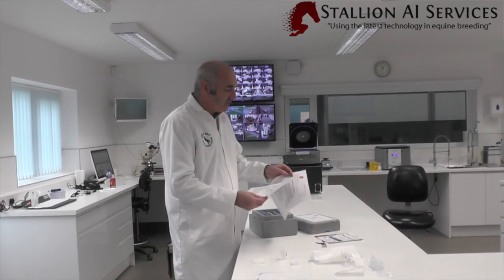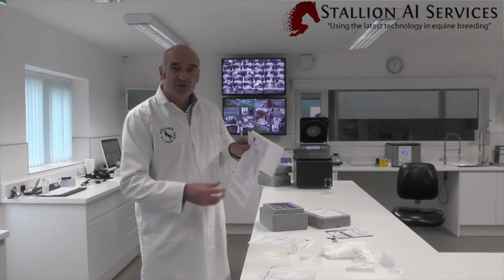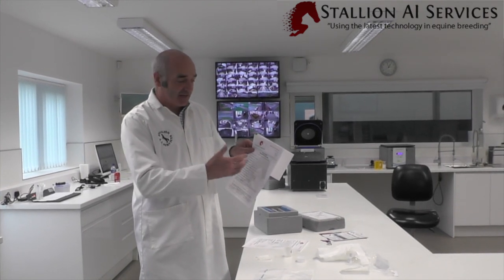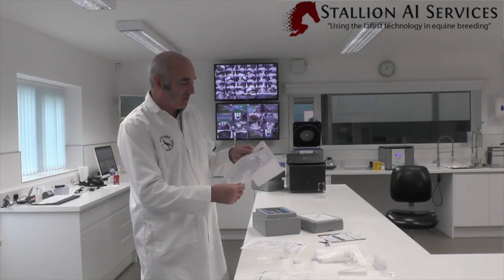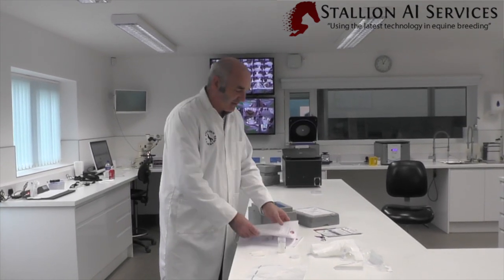The other piece of information included is a chilled semen mare insemination form. When it gets there we want to know who they are, who's AI'd it, whether it arrived in the right condition, whether the semen is good enough quality, and we also put a self-addressed envelope in there as well.